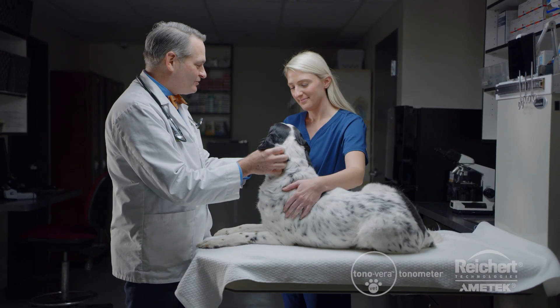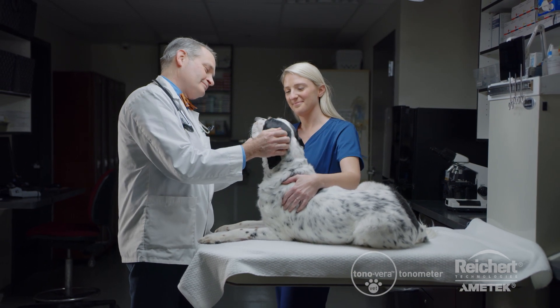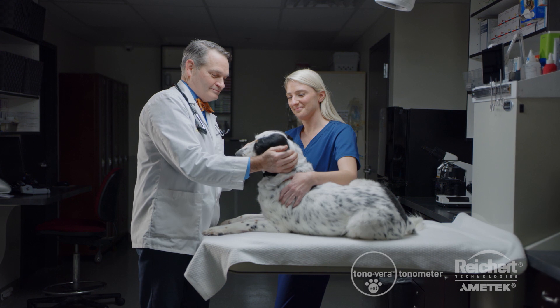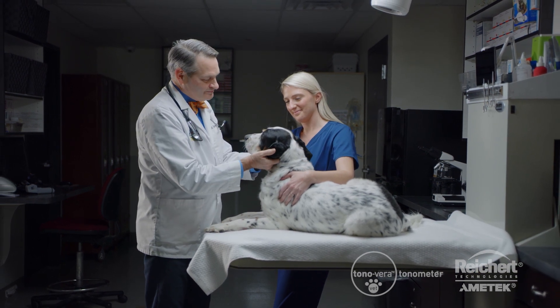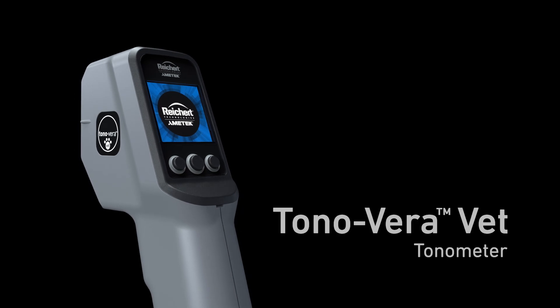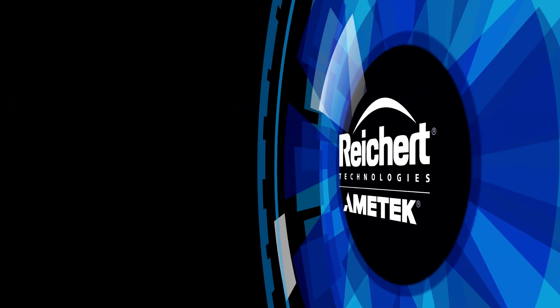The Tanavera Vet is my preferred tonometer for getting fast, reliable results with a single measurement and allows for a less stressful exam for our patients. The Tanavera Vet tonometer by Reichert Technologies — the right measurement, right away.